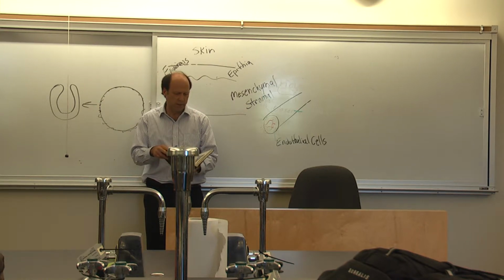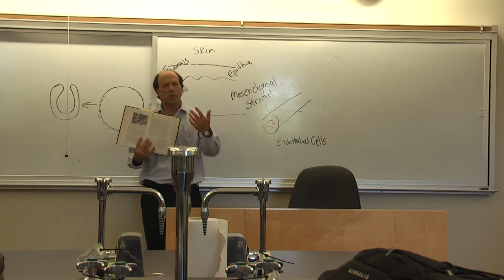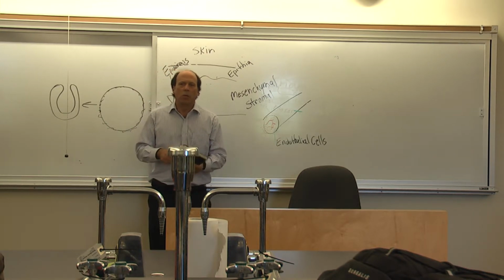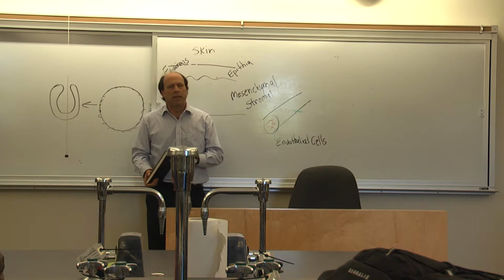I mean, the pictures are better. Now they're in color. Resolution is better, and you can see them on your iPhone and all that kind of thing. But that's still a picture. What we can do beyond that is we can use antibody reagents to pick up certain proteins that we know are in that section of tissue somehow, and so we can track where those things are.